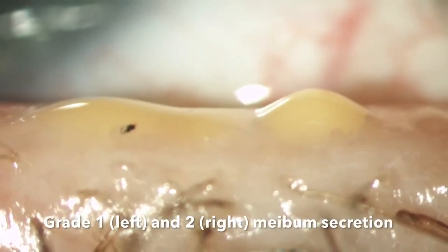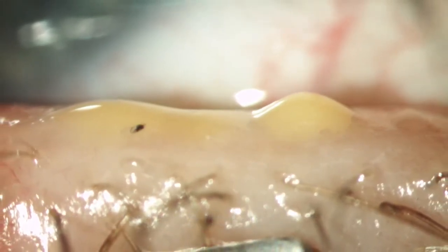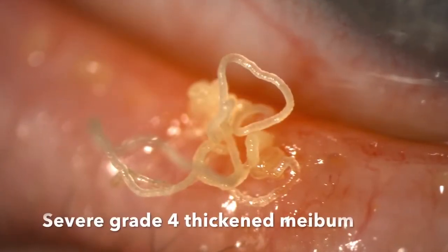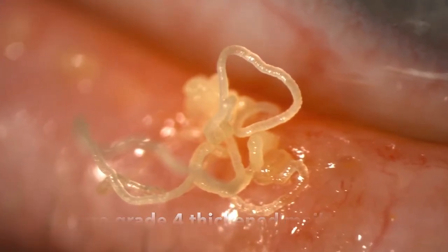This image shows on the left a grade one blockage and on the right more like a grade two blockage. Often the blockages of adjacent glands are not the same grade or level. This image shows obviously severe grade four thickened meibom — very blocked and quite a lot of it coming out with expression.